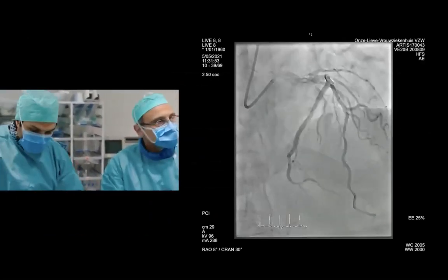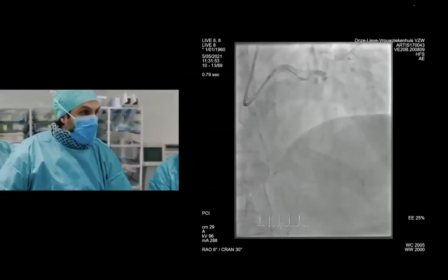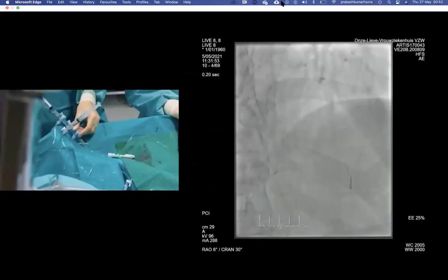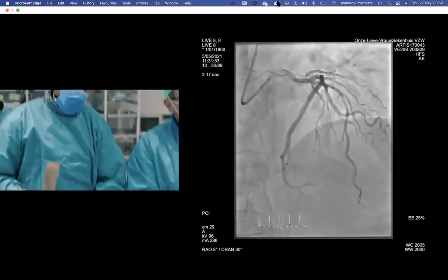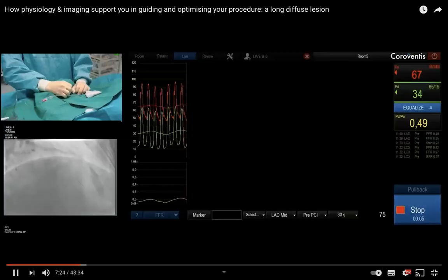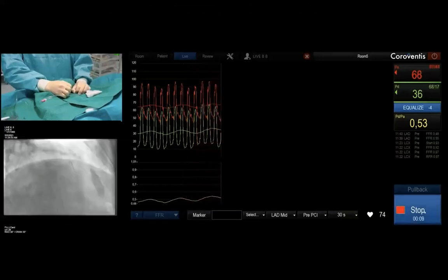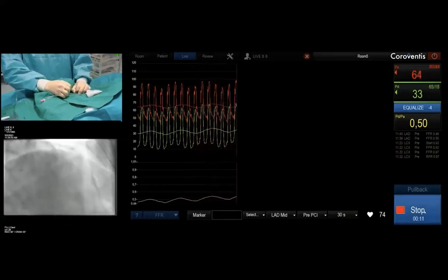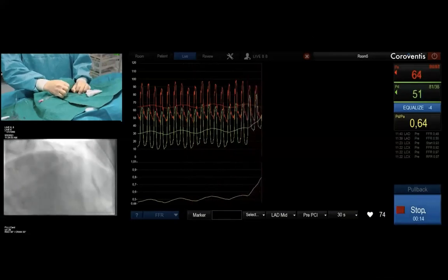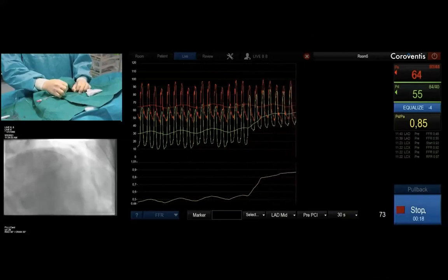We have positioned the wire distal in the vessel. Now we are going to proceed to measure FFR. I am going to flush the system with saline. This is to obtain high-quality pressure traces, and this is an important step to avoid artifacts. We have a stable pullback until the tip of the pressure wire.